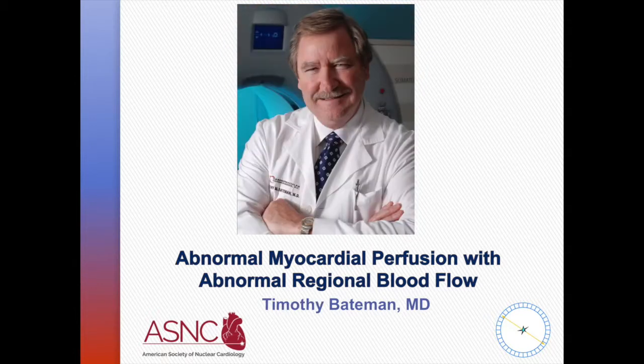So, Faraz, you've developed somewhat of a reputation over the last few years about analysis of radiation exposure by different techniques that we use in the hospital. Do you want to tell us a little bit about rubidium PET exposures compared to other radiation-bearing approaches that we might use in a patient like this?